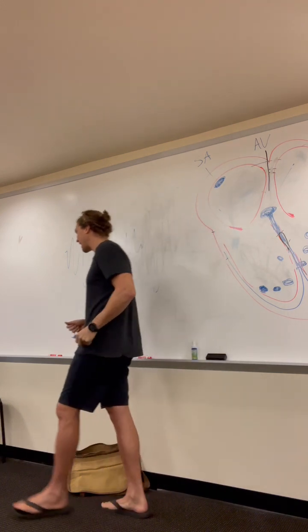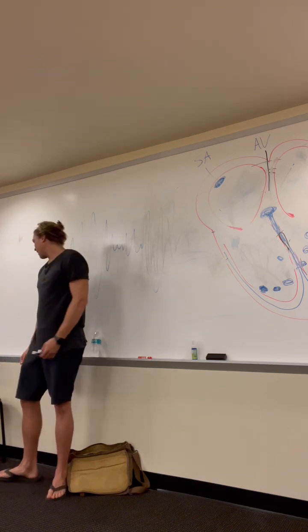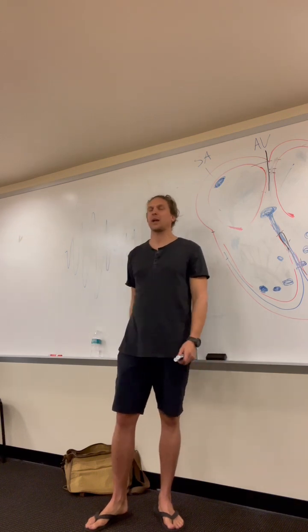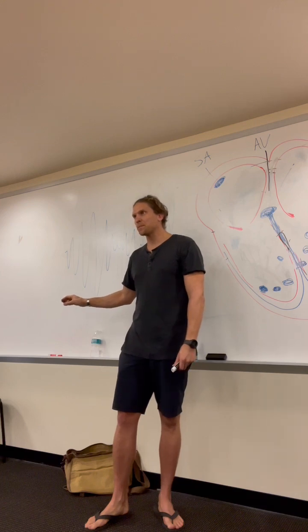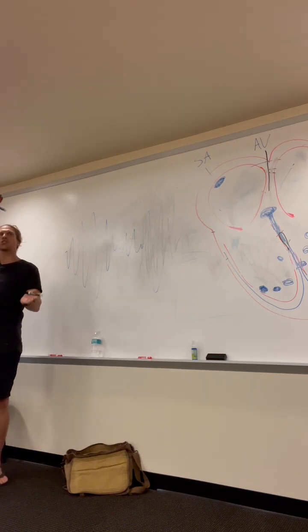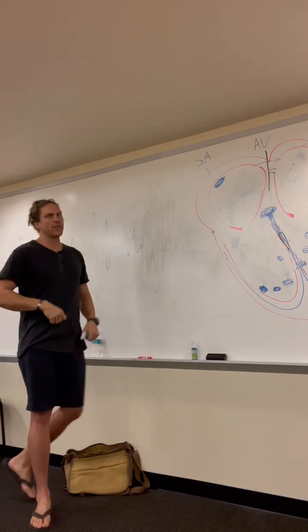And if you really look at it, you can see how this one's more twitchy than torsades. But don't get confused, because look at it there and agree that there is some twisting along with it, okay? So memorize this picture, that this is the one for v-fib, and then usually torsades is an obvious crescendo, decrescendo, and that'll help you identify the two.